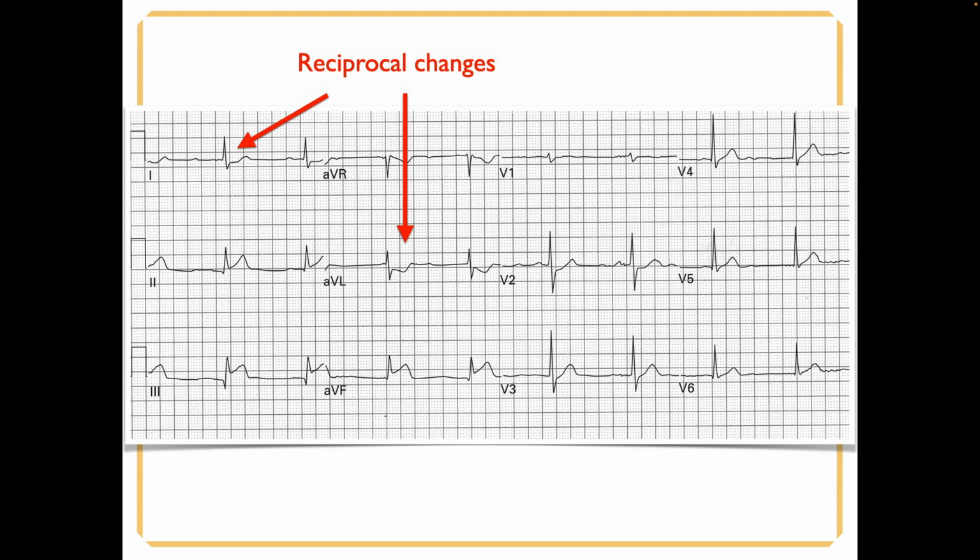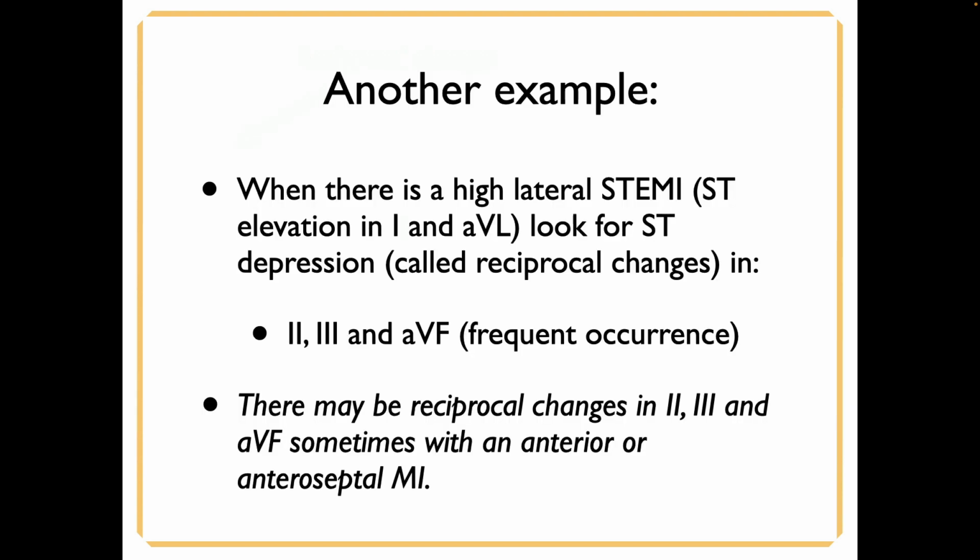Okay? Yes? Are you looking for the same amount of depression as elevation? No, no. That doesn't matter. In fact, it's still considered reciprocal changes if it's only aVL. You just gotta confirm it in one of them. Only one will do it. Yeah. Alright. Okay.